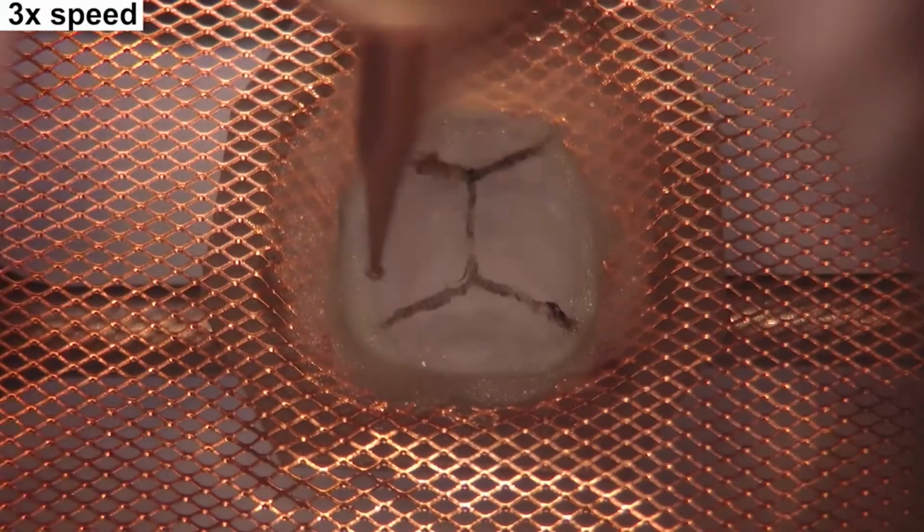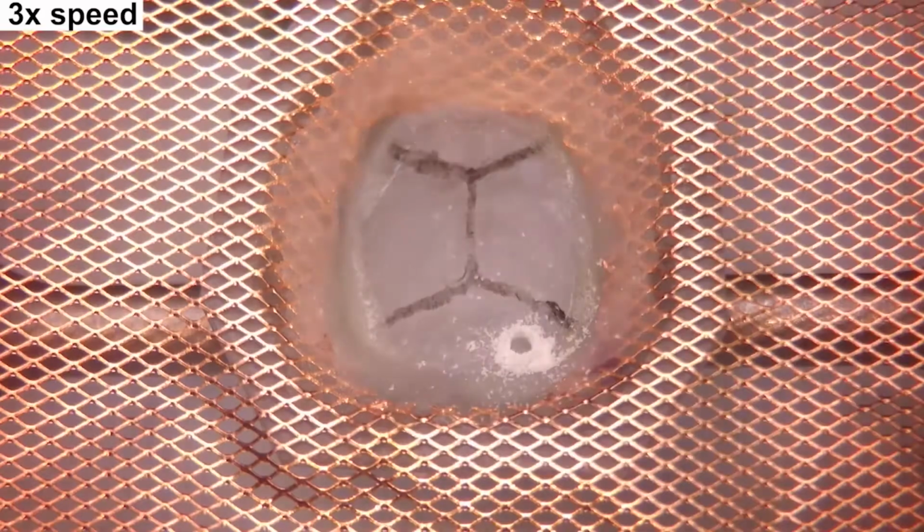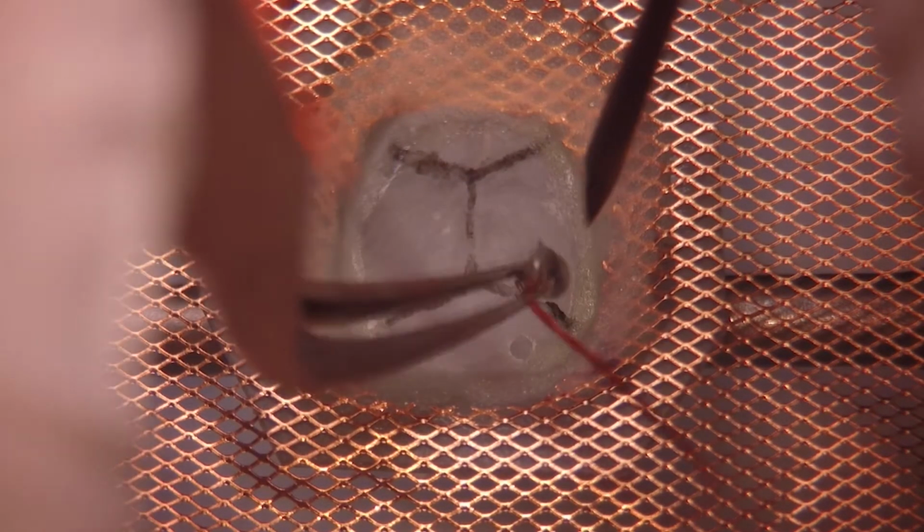So once this base is attached to the skull, then we can place a ground screw above the cerebellum or any other location that you usually use. It really doesn't matter.